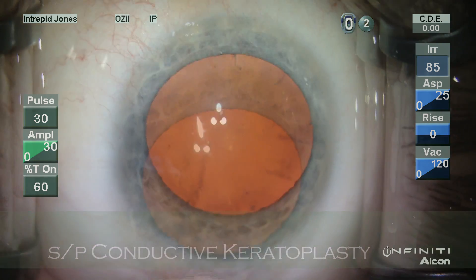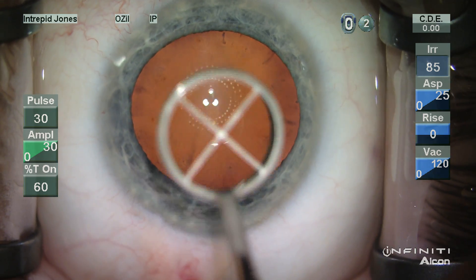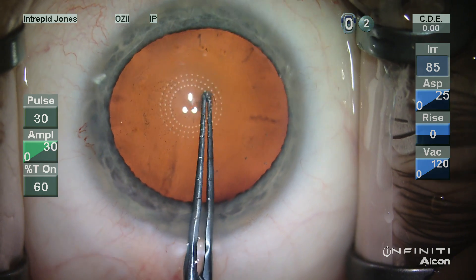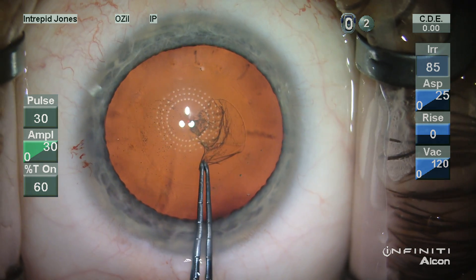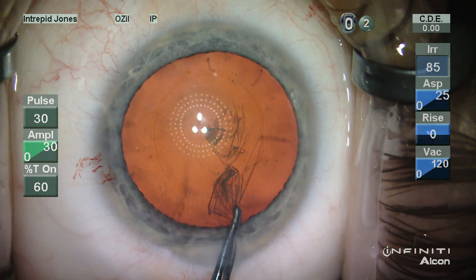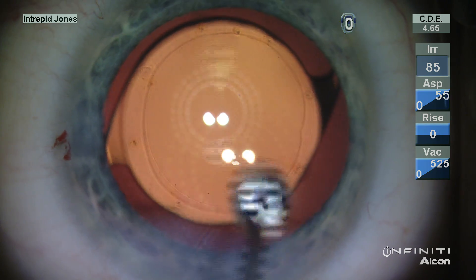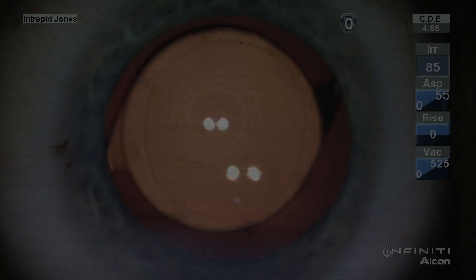This patient has had a previous conductive keratoplasty and once again the patient fixates, the corneal mark is applied, and the capsulotomy is created. Because of the discrete fixation elements from the beacon, patients are more readily able to maintain fixation during the capsulotomy maneuvers, which aids in a more controlled and centered location. Here you can see the concordance of the keratoscopic readings as well as the CK scars and anterior capsulotomy.